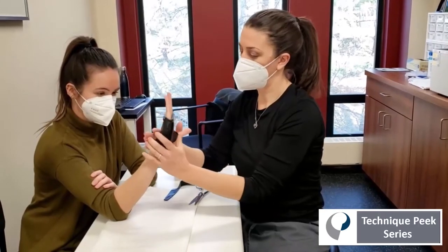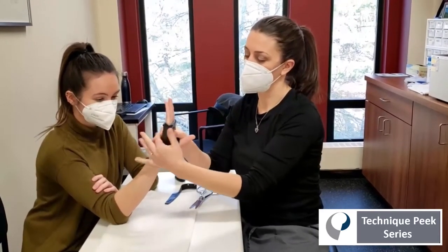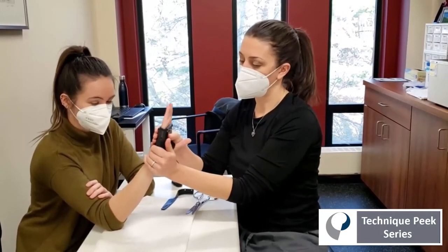Get that nice snug fit, making sure that the patient is straight at the MCP joints, because oftentimes they'll start to trend down into flexion.